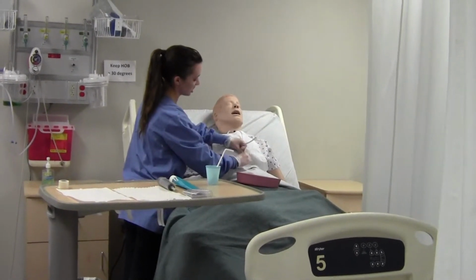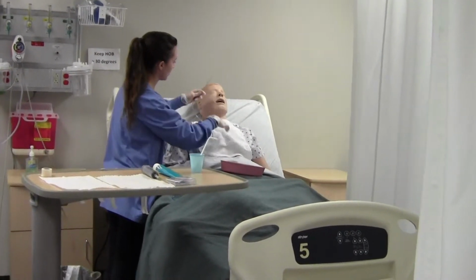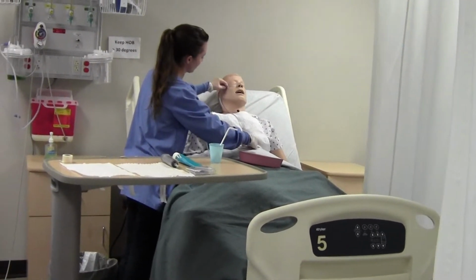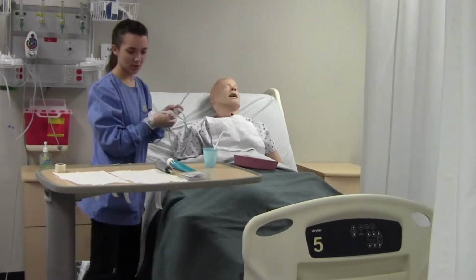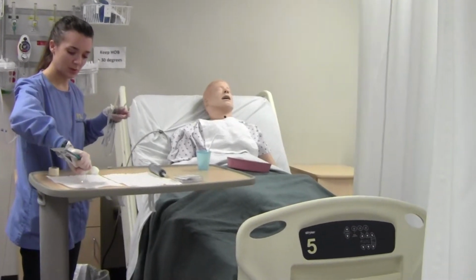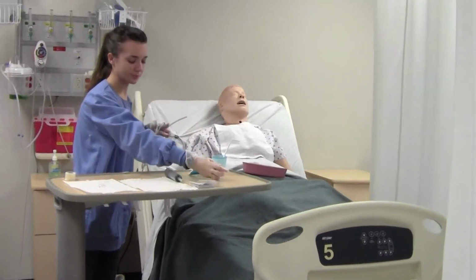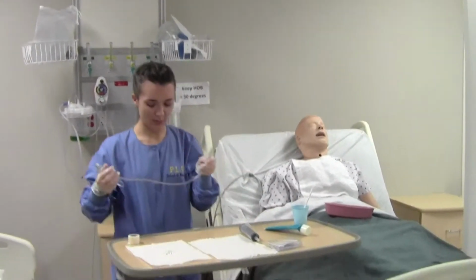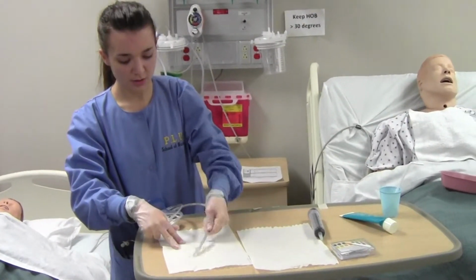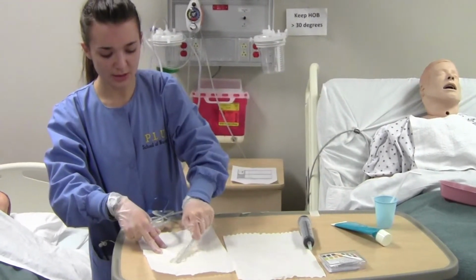And I'm going to actually pinch it, and I'm going to tape that with a little tape. Here we have, check it again, nasal to earlobe to xiphoid process. And that's going to work for us. Okay, perfect. So now I'm going to take our lube and squirt some lube. Okay, Mr. Templeton, so now I'm lubing this right on up, making sure all the little holes are covered, and this will just help it slide down easily.